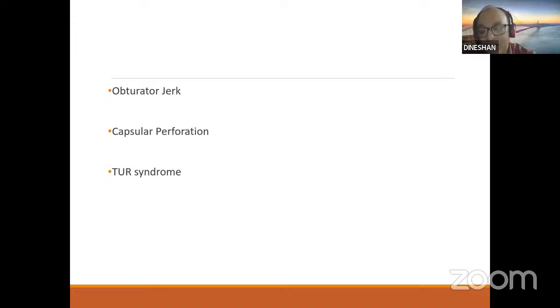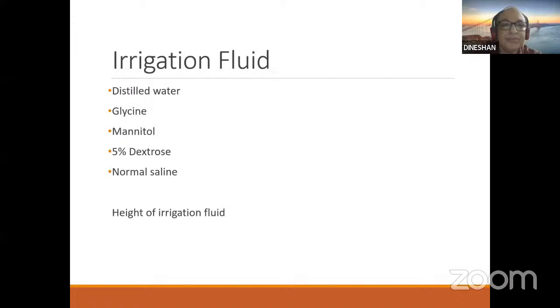The prostate will grip more on the resectoscope. The movement of the resectoscope will become stiffer, difficult. So if you find any of these things, you must always suspect a perforation and look for it and stage the procedure. So these are the notes on the capsular perforation.